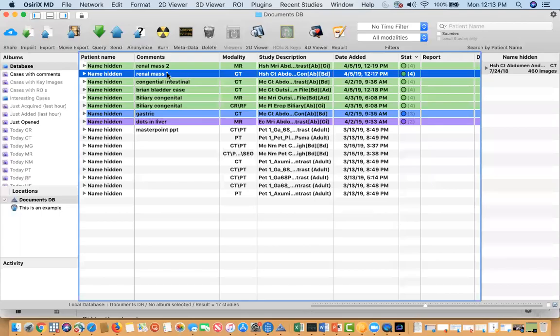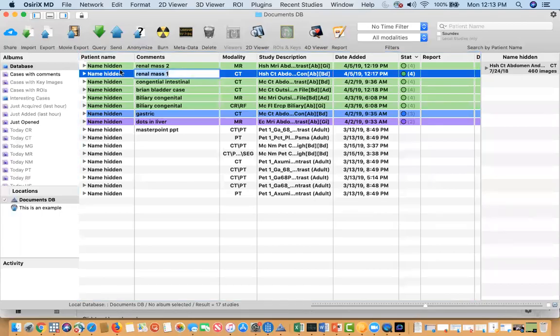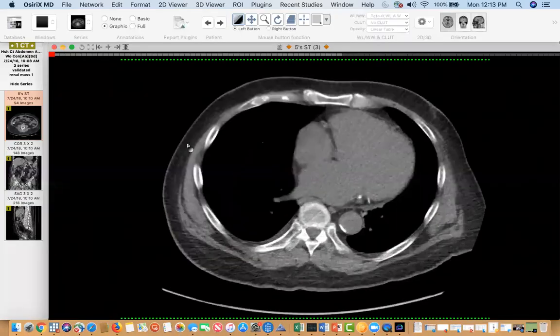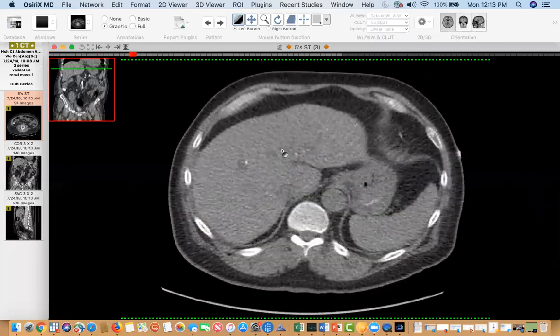Is a CT, and then we have a follow-up MRI. Steve, you just missed a mesenteric lymphangioma, just like your case. Not responding.